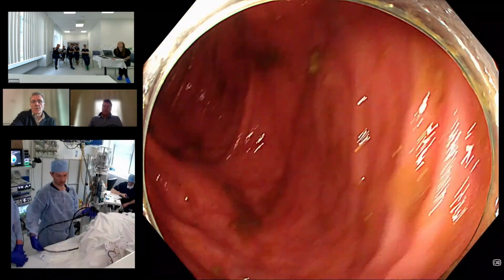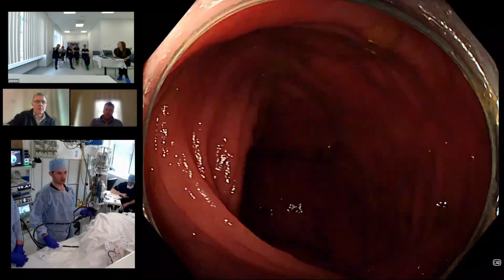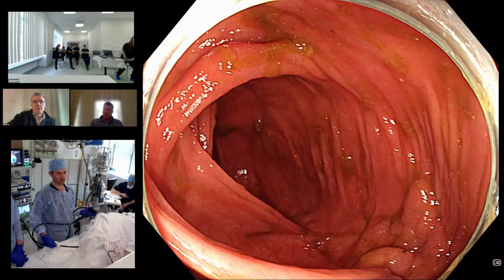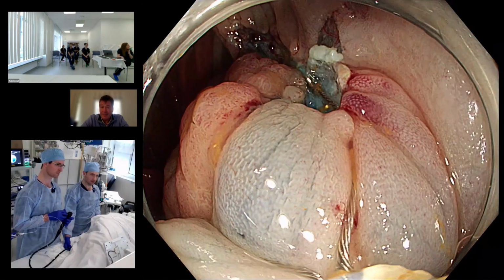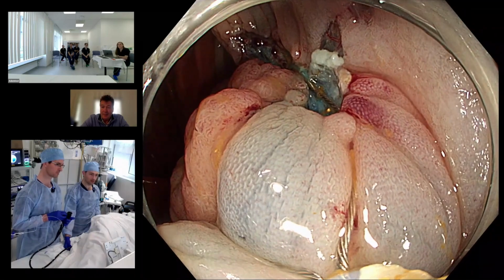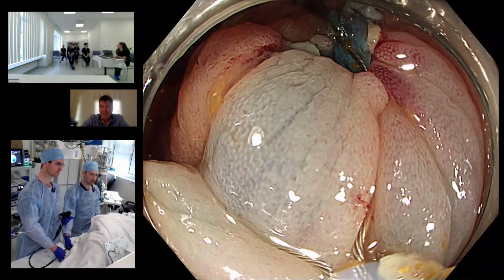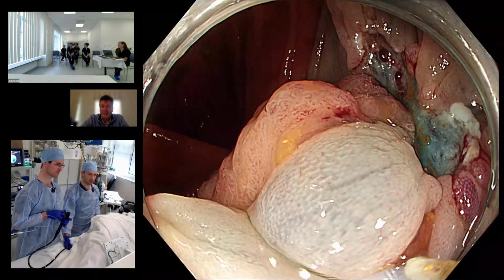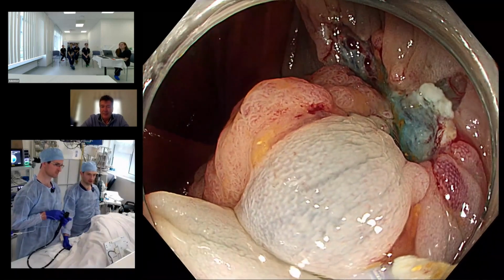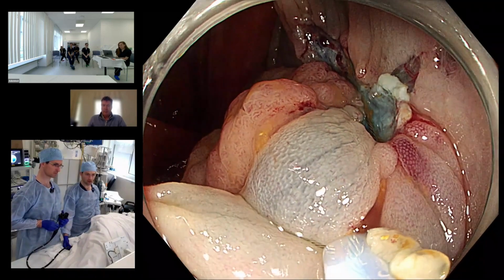Okay, so let's come back then. That sort of thing can take a long time. I think we're illustrating that. Okay, we now control the tip. You think you need to push the scope in a little bit more, get us into that area a bit more. I've torqued anti-clockwise. Right, this looks pretty good. Okay, so I would ask for slow closure now. Follow it with the snare.